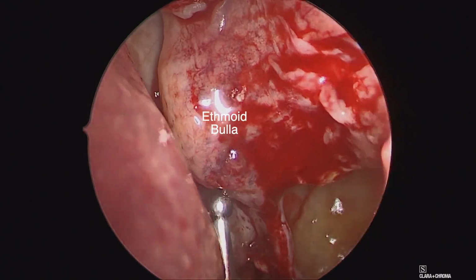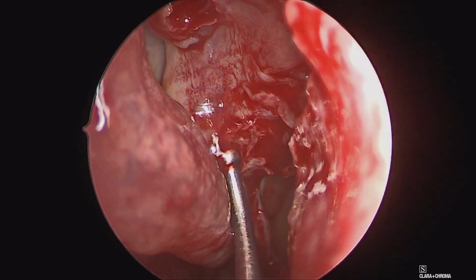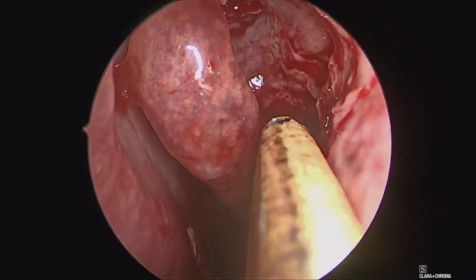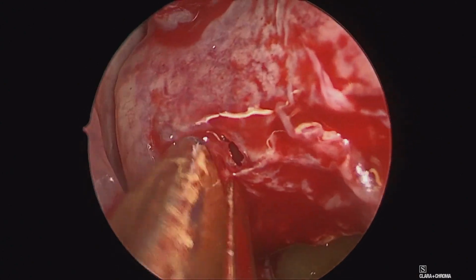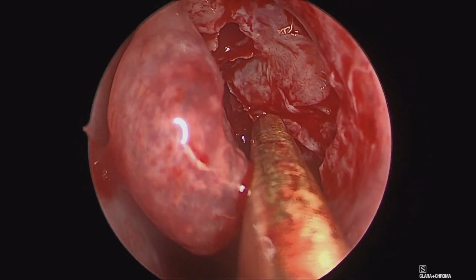Then here we are identifying the ethmoid bulla, and we'll simply enter into the face of the bulla here with a maxillary ball probe, and then remove this with a Carlson rongeur, an up-biting Carlson, as well as a microdebrider. The most important part with our ethmoid bulla dissection is not simply removing it, but also identifying the basal lamella just posterior to it, as well as the lamina papyracea on the lateral aspect.